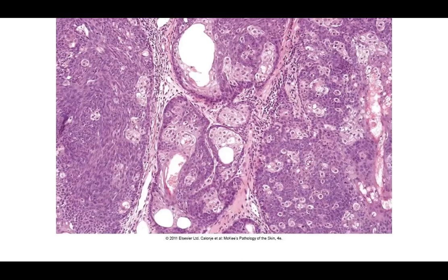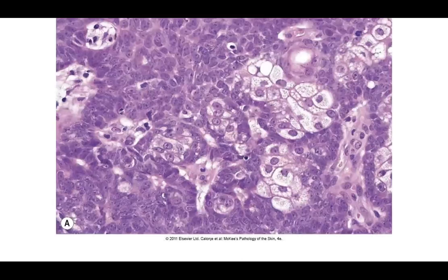Here's an example of relatively bland basaloid cells with scattered well-differentiated sebocytes — this is a sebacioma. On higher power, you can see the bubbly nature of the cytoplasm within the well-differentiated sebocytes, and most of the basaloid cells have very similar nuclear size with no significant mitotic activity.